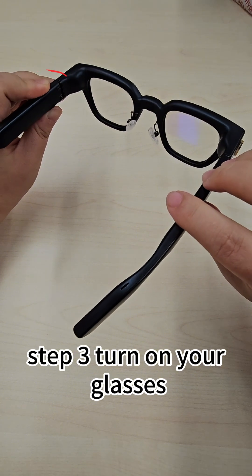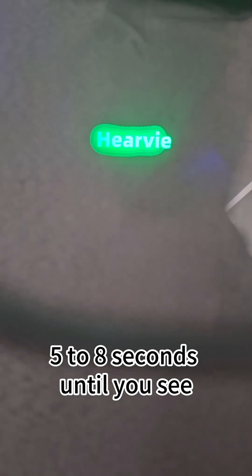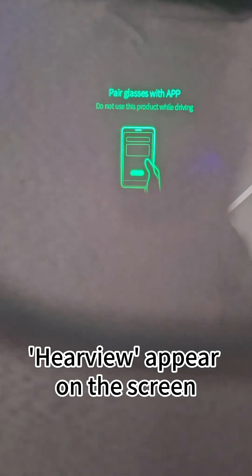Step 3: Turn on your glasses. Press and hold the power button on the left temple for 5 to 8 seconds until you see HearView appear on the screen.